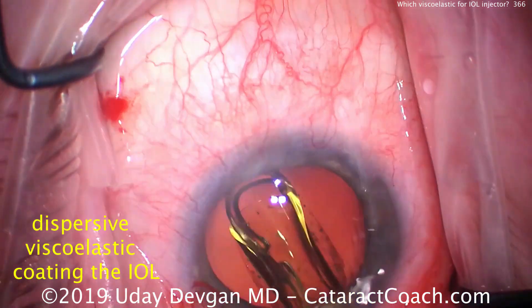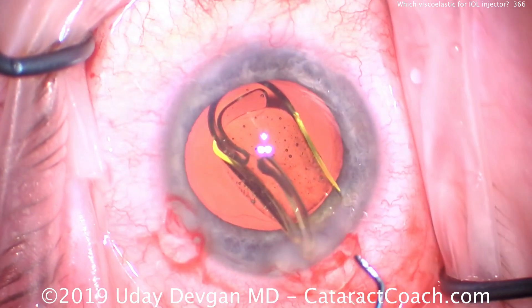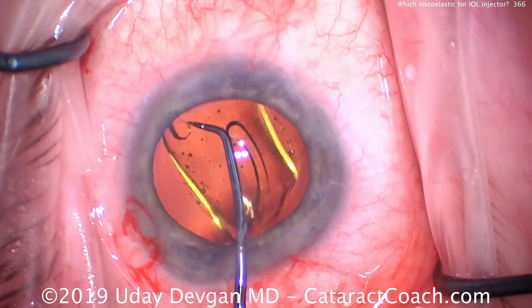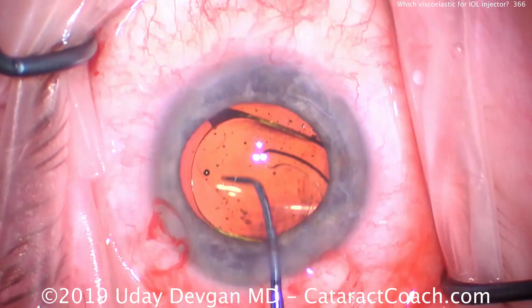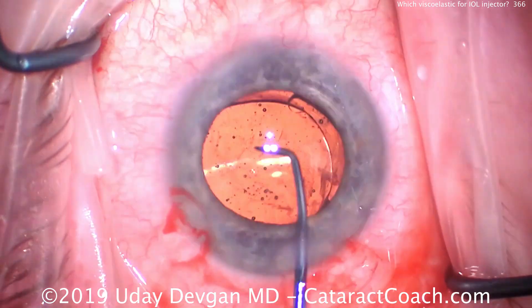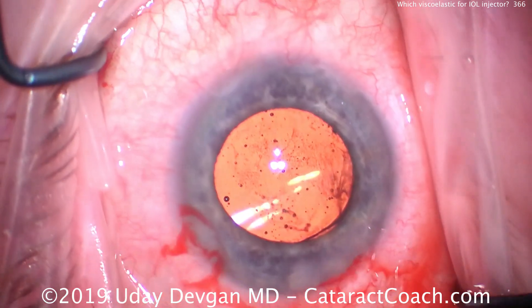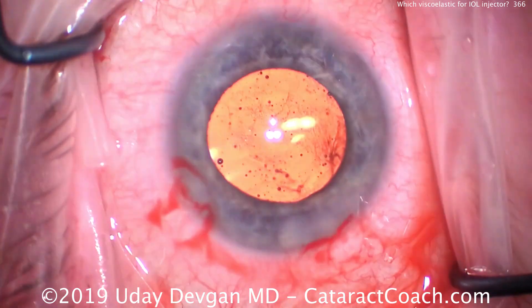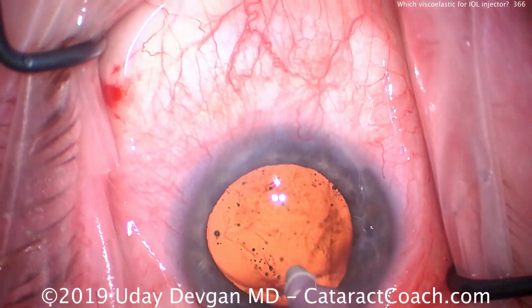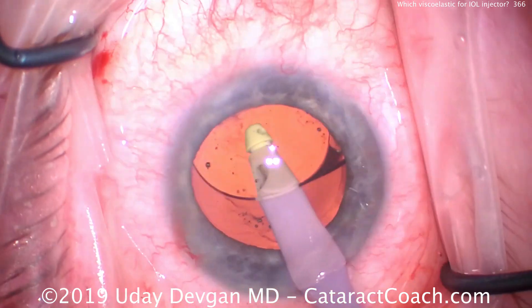In this case we ended up having some air bubbles in the dispersive, which makes it very easy to see during this step of the procedure — that's why I chose this clip for the video. You can see the air bubbles in the dispersive highlight that we still have dispersive agent covering the front and back surface of the IOL.